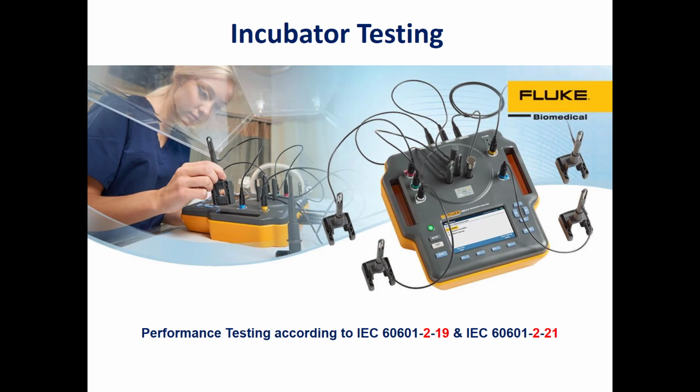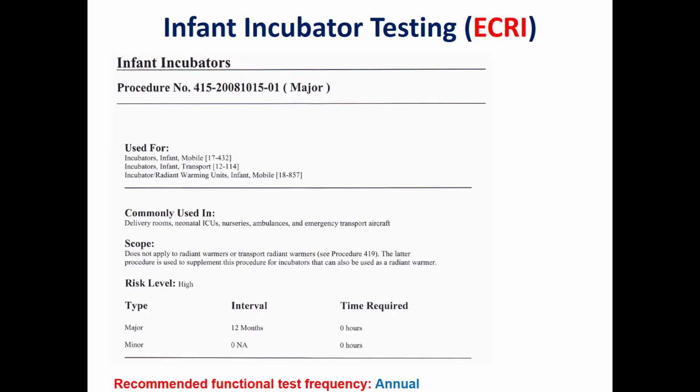As we said before, the testing should be done according to a specific standard. For this infant incubator, the electrical safety testing should be done according to IEC 60601-1, and the performance testing of an infant incubator will be made according to IEC 60601-2-19. So what is the IPM?